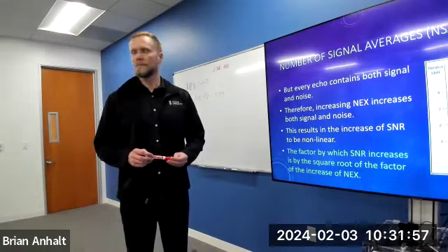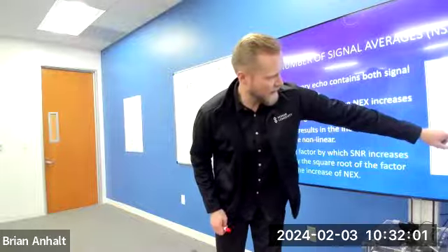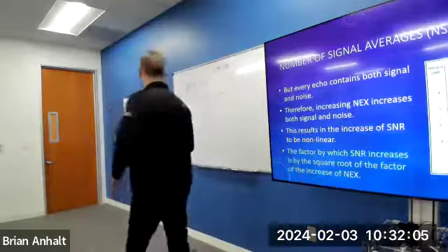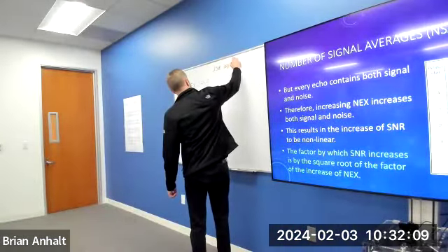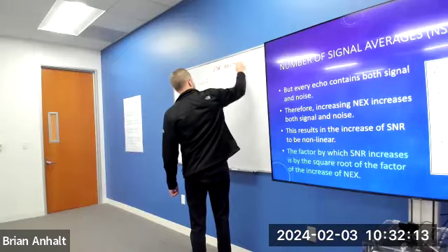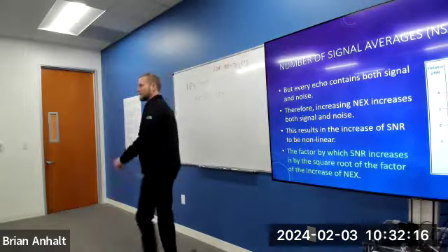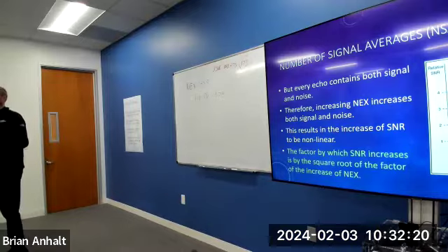Yeah. And you can see here, 1 to here to 3, right? That looks about 73%. So my new SNR is 100 times 1.73, which is 73% more signal, right? By tripling the NEX. Here's the trade-off though. What happens if I increase my NEX besides getting better SNR?